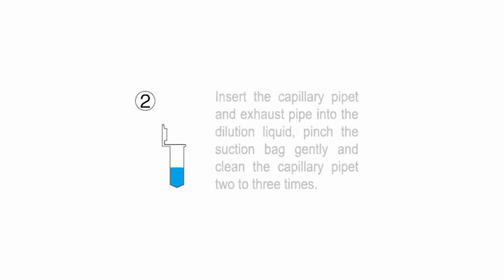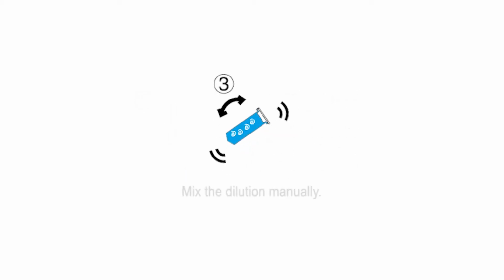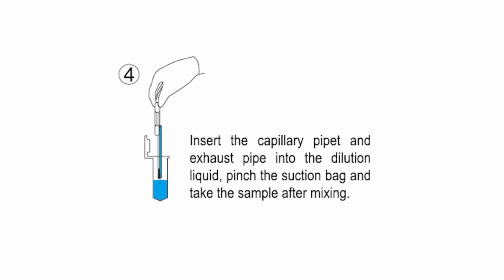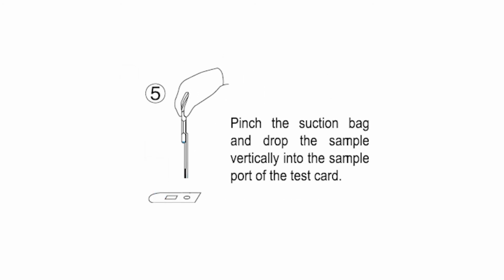Insert the capillary pipette and exhaust pipe into the dilution liquid. Pinch the suction bag gently and clean the capillary pipette 2 to 3 times. Mix the dilution manually. Insert the capillary pipette and exhaust pipe into the dilution liquid. Pinch the suction bag and take the sample after mixing. Pinch the suction bag and drop the sample vertically into the sample port of the test card.